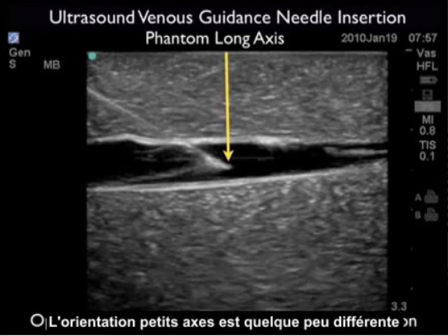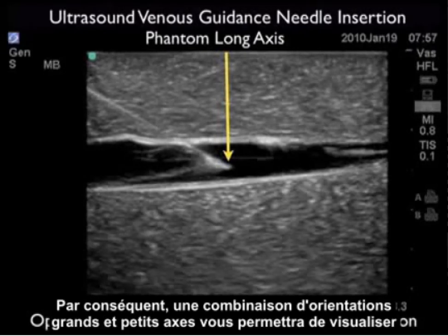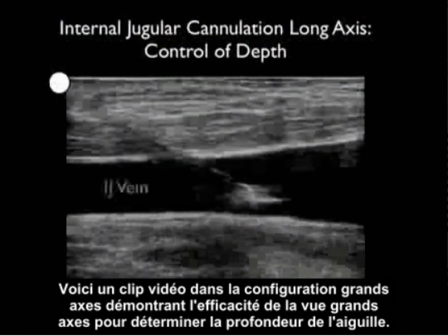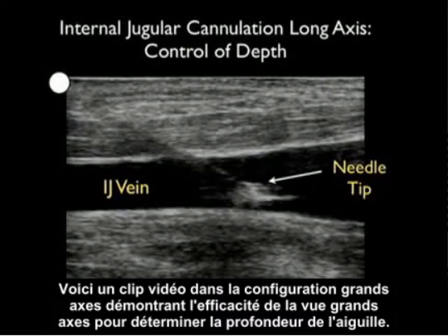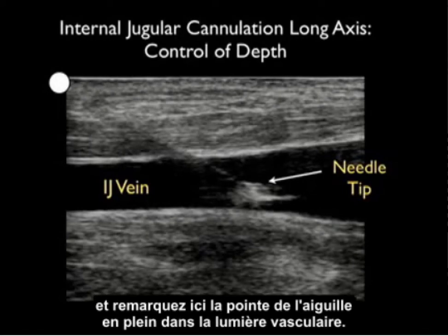This is in contrast to the short axis orientation, which was better for lateral needle orientation with regard to the vessel lumen. So using a combination of short and long axis orientations will allow you to see both lateral and vertical needle orientations with regard to the vessel lumen. Here's a video clip in the long axis configuration emphasizing that the long axis view is great for determining needle depth — here we see a needle coming in from left to right and we can visualize the needle tip squarely within the vessel lumen.